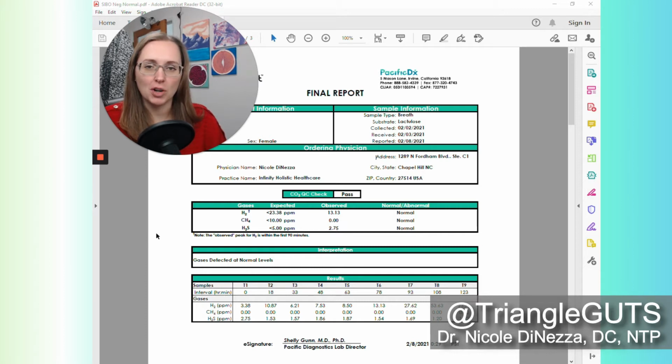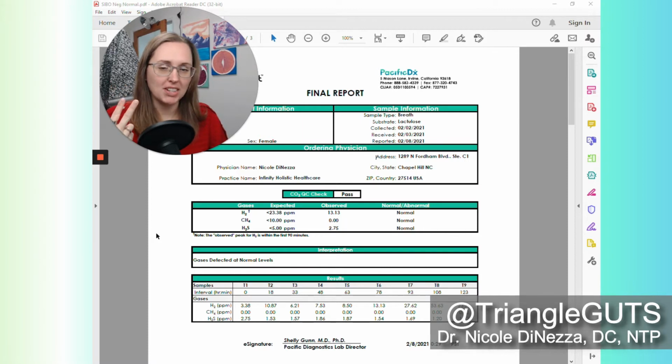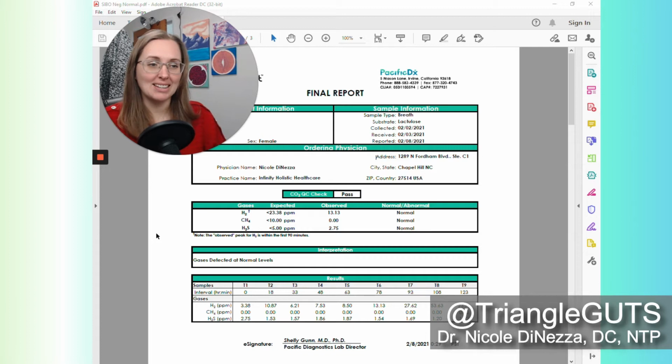But I do find that the interpretation of SIBO breath testing overall and the Trio Smart test in particular can be a little bit unclear, shall we say. And I want to lead you through how I go about interpreting these, and I'm going to show you a whole ton of different examples of what this test can look like. And spoiler alert, what I have found is that hydrogen sulfide SIBO is not nearly as common as we thought it was, in my opinion. I mean, the company would tell you otherwise, but I'm going to get into that a little bit throughout the video. So hang tight and we're going to go over this.